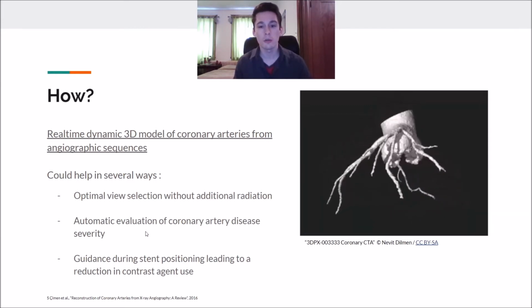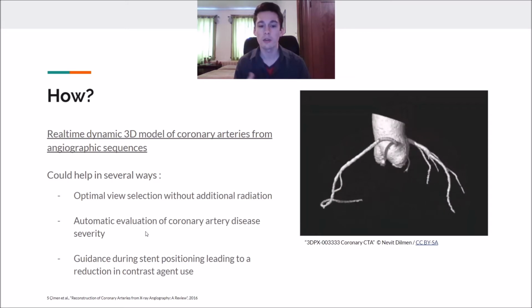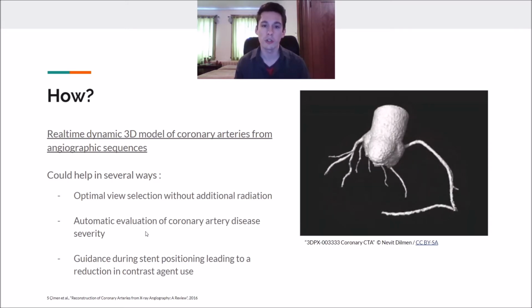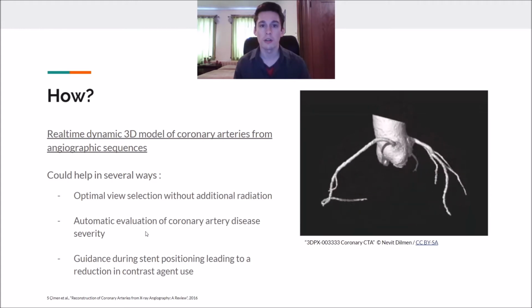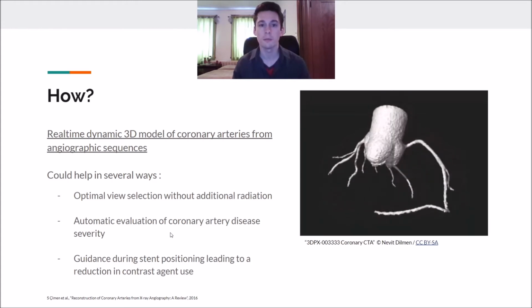And it could also guide them during the intervention, which would lead to a reduction of the contrast agent that would be injected into the patient.